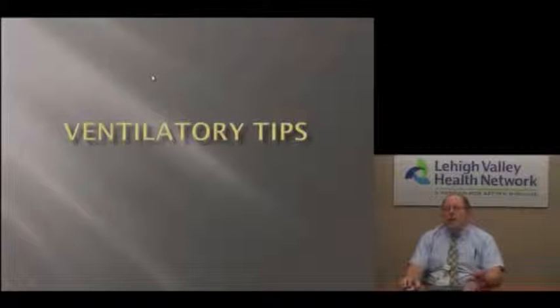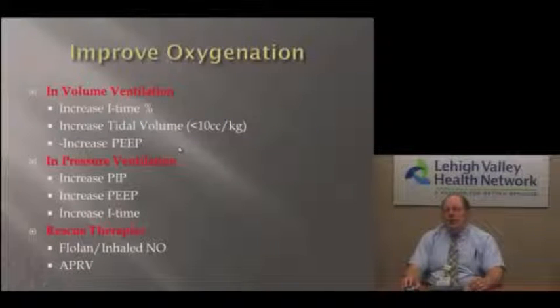Now, those are an overview of the modes of ventilation. Again, some of those modes you may not use, but I think it's important to understand their rationale and what they are used for in a clinical scenario. I wanted to just throw in some ventilatory tips here.